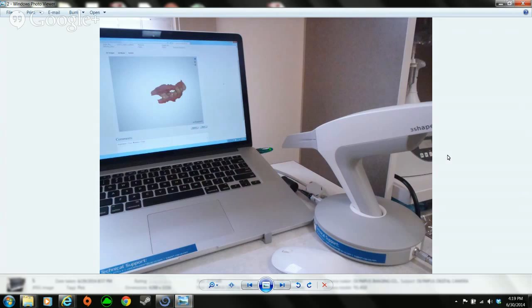The only element that I could think of changing to make it any more perfect would be to eliminate the doctor and use a robot to place the implants. I haven't built the robot yet, so. But yes, they're extremely accurate, and they fit with very little post-printing finishing of the surgical guides. Everything works really well.